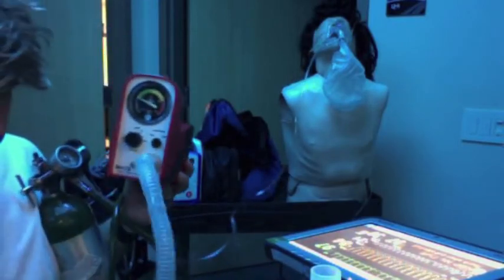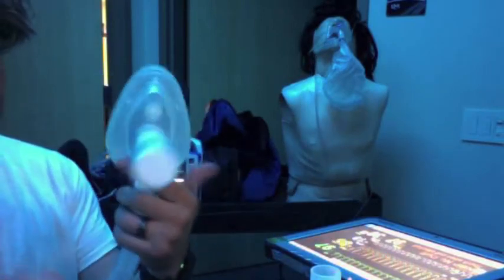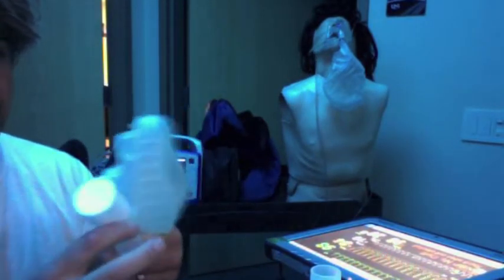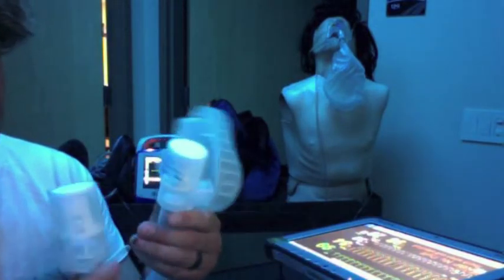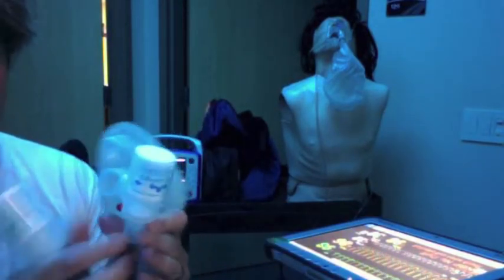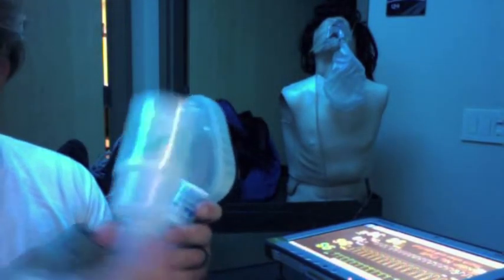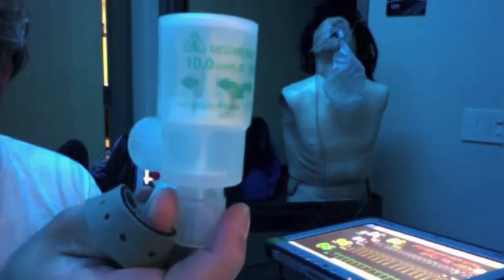So that connects to the back of your CPAP device and of course your tubing. Your mask is like a bag valve mask. And this specific brand has different CPAP valves. So this one is a 5, and we have a 7.5, and we also have a 10.